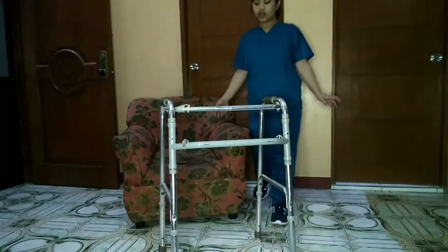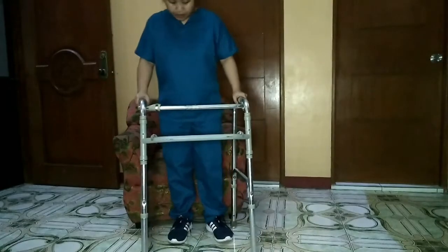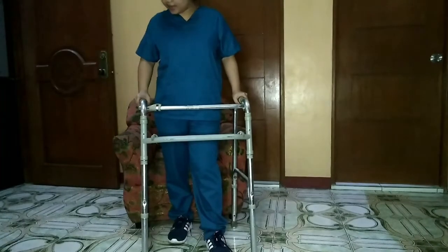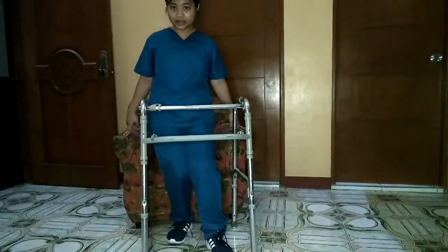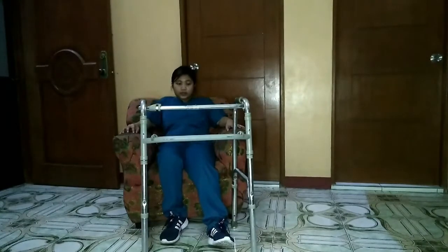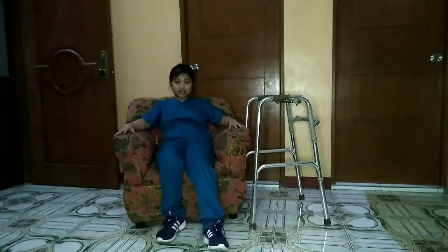For example, with this walker, if the patient wants to sit down in the chair, the patient must at least move the weak foot forward and then hold the grip, and after that, hold the armrest and then slowly bend the strong knee and sit down like this. And then if they want a comfortable position, move the walker, the cane, and the crutches to the side and then sit down.